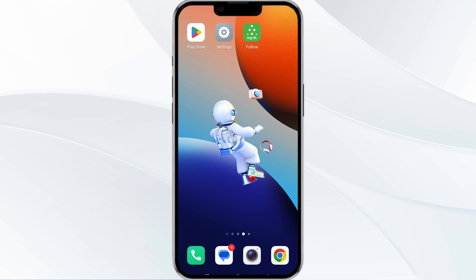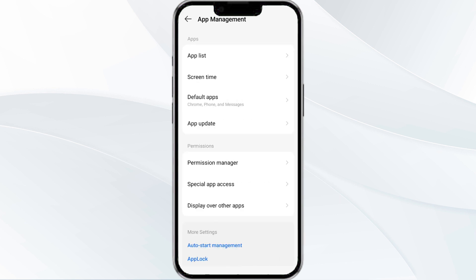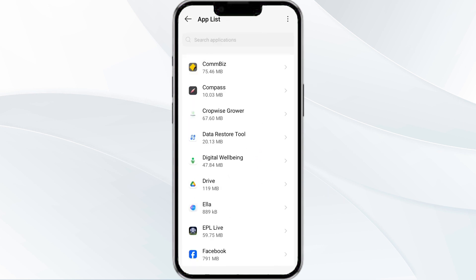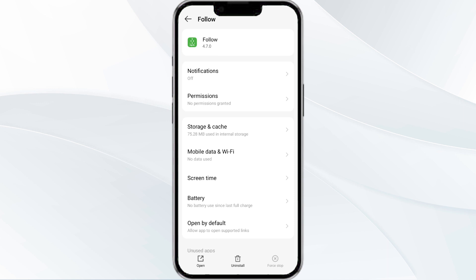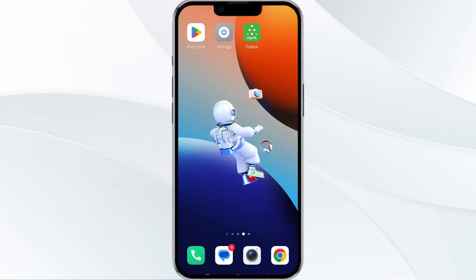To do this, open your phone settings and navigate to the App Manager. After that, select the Follow app from the app list, and then find the option to force stop in the bottom right corner of your phone. Click on it, confirm, and then reopen the app.